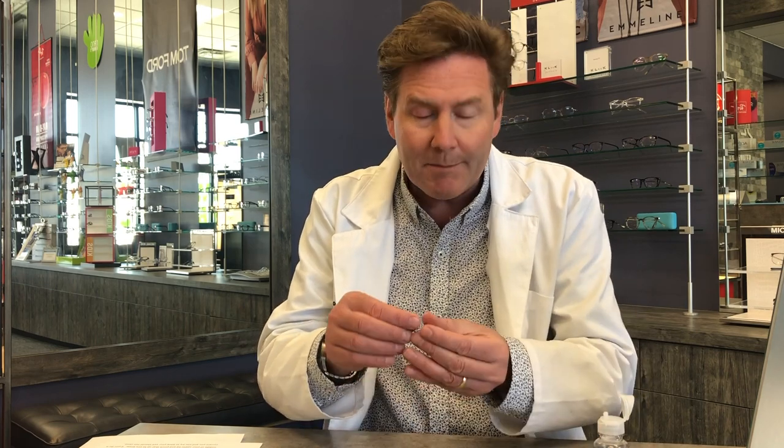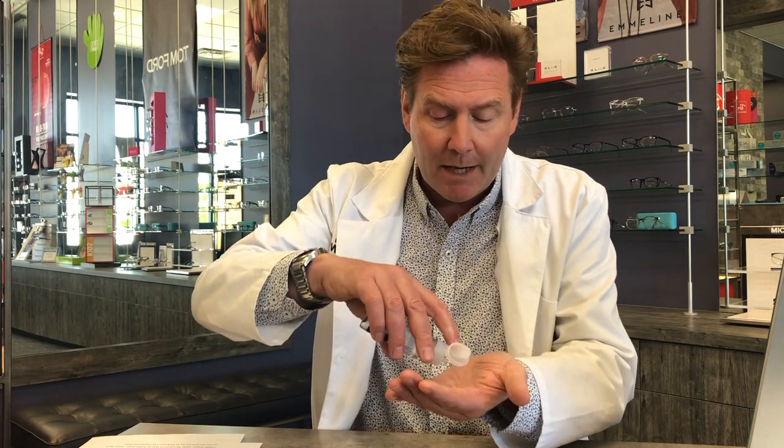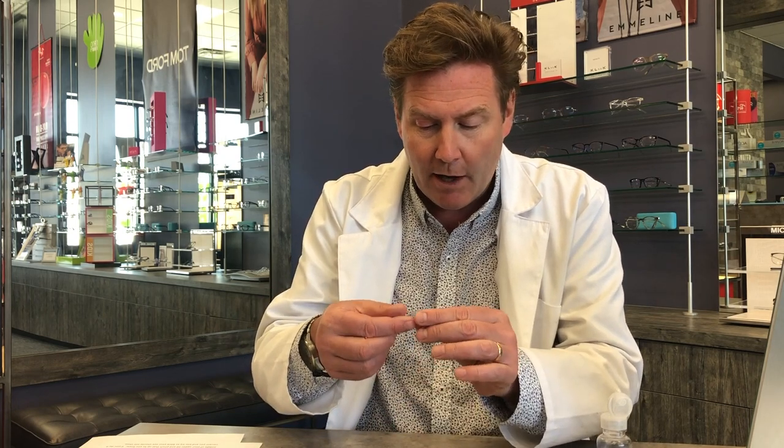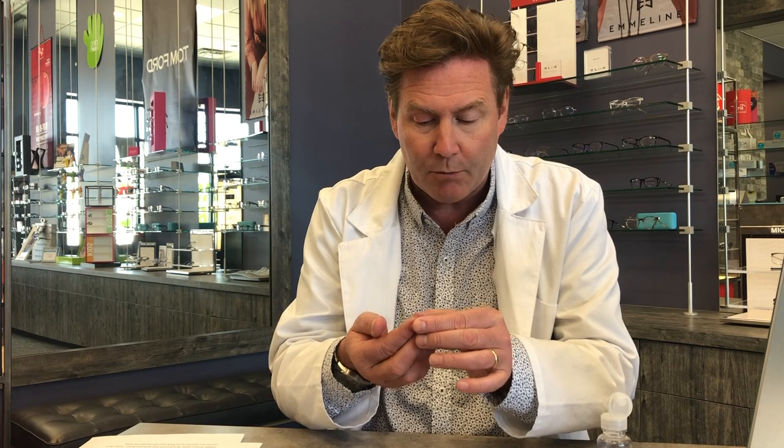During the process of putting contact lenses in, sometimes you're going to drop that contact lens or the lens will start to dry out. If that happens you want to rehydrate it or rinse it off. Your contact lens provider will have an approved contact lens solution — take that lens, rinse it a little bit, and that will help rinse off any lint or dust or help rehydrate it so it's okay to put in your eye.